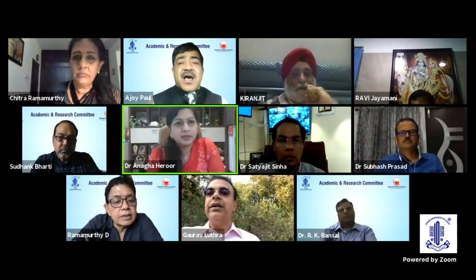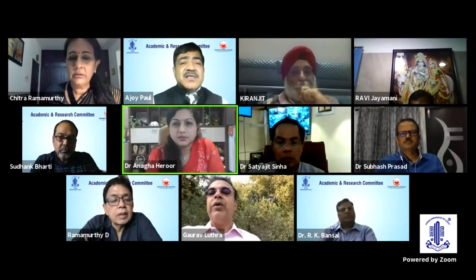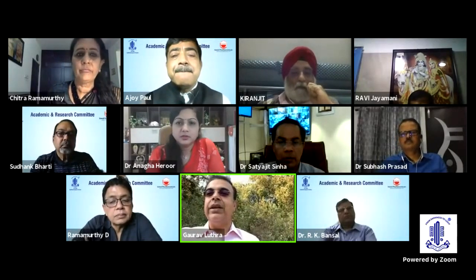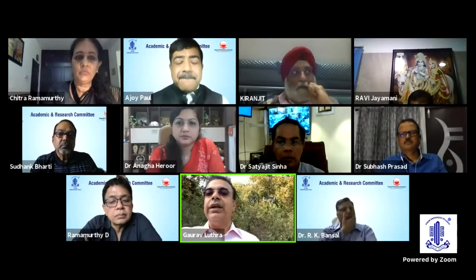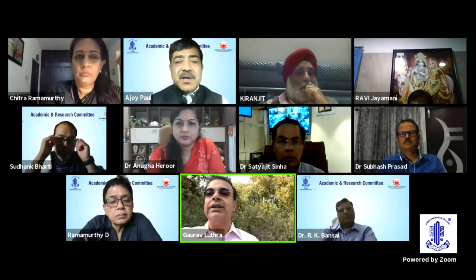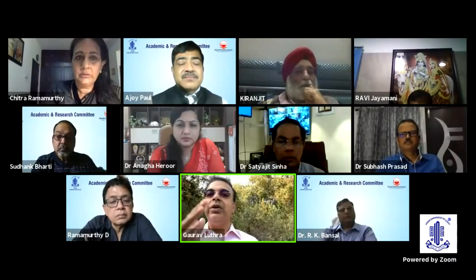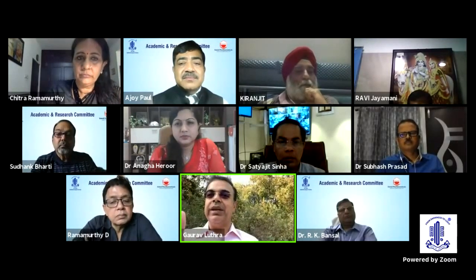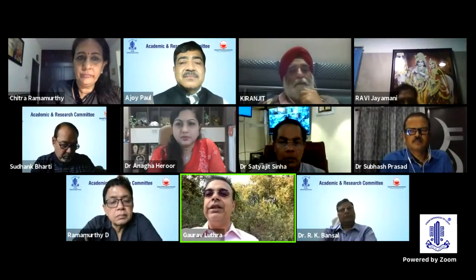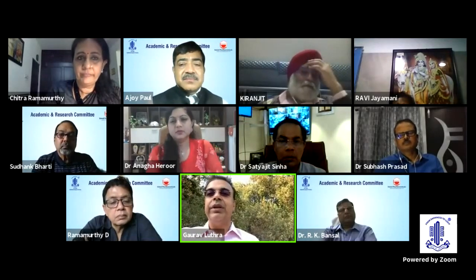Ma'am, another change, I think. Up to 1000. Right. Ma'am, I wanted to suggest that other than the offset, it's important also to decrease the number of passes and decrease the energy, so that you're using a technique of segmentation where you're not going on for too long at high energies, because that causes cavitation. I mean, that causes the bubbles to form and that can expand the bag. So I use a single pass, as Dr. Chi has explained, and it's working beautifully well last few months for me. And using the right energies and shorter times and lesser bubble creation also is going to be very helpful in these cataracts.